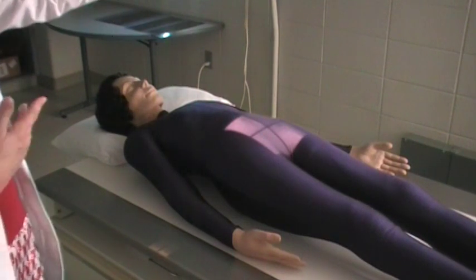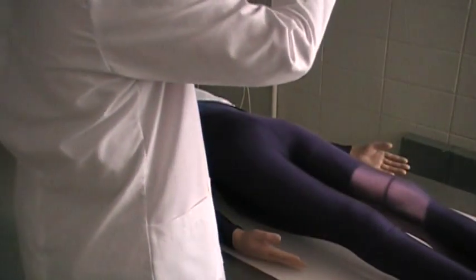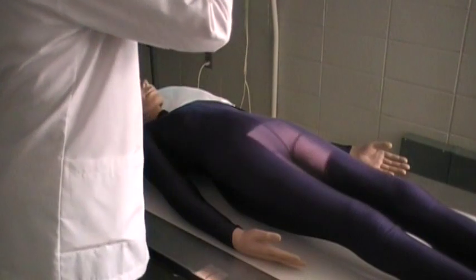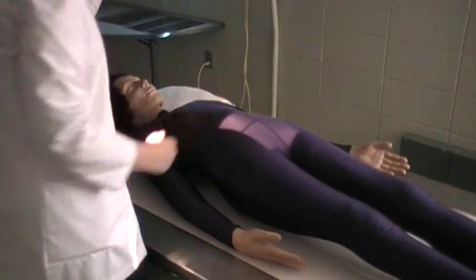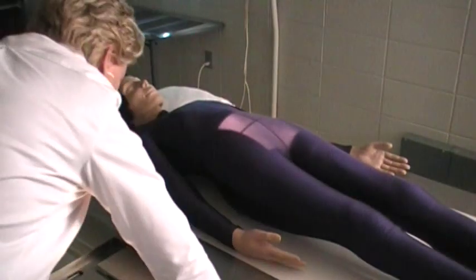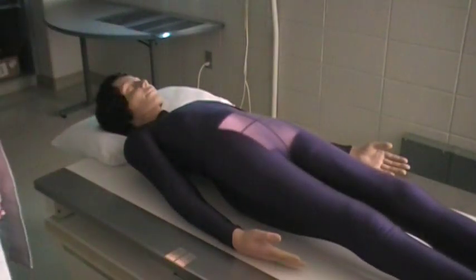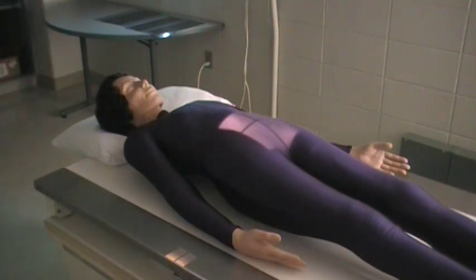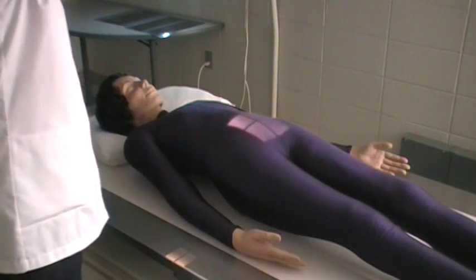To do the AP axial of the coccyx, we're going to change our angle so that it is 10-degree caudal. It will enter at the same level — 2 inches above or superior to the pubic symphysis. Be sure to line your bucky tray after you have changed your angle. You can collimate a little bit tighter for the coccyx.